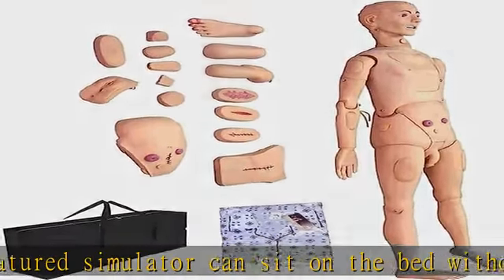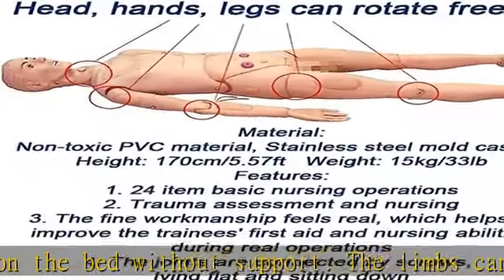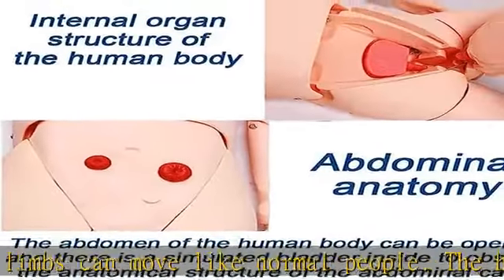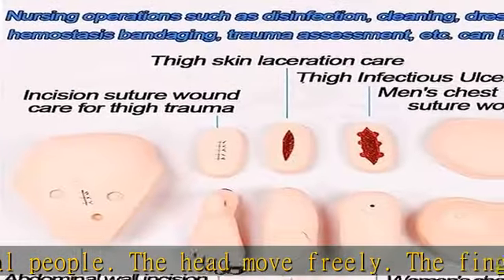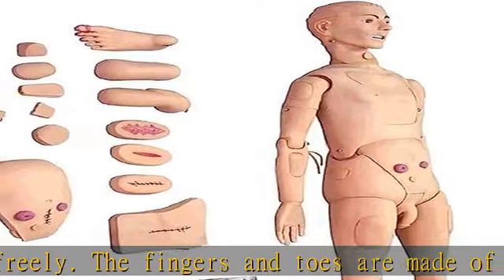It enjoys a longer service time while remaining light. This nursing training mannequin is life-size at 170 cm (5.5 feet), with realistic flexibility of limbs and joints. Various positions can be realized, and it can simulate bathing and changing clothes for patients in bed.